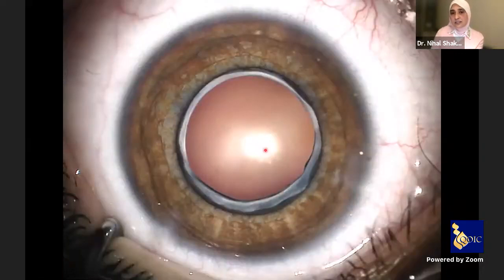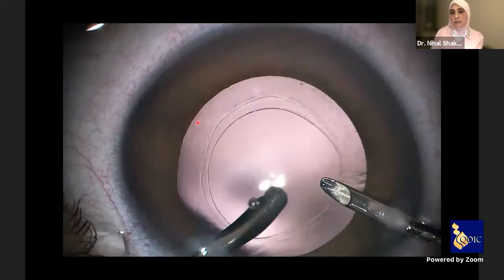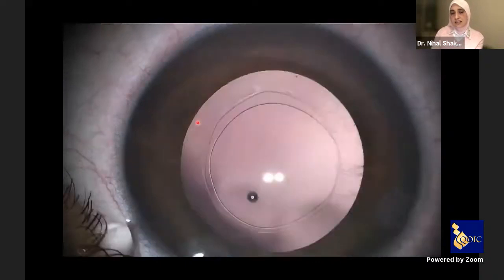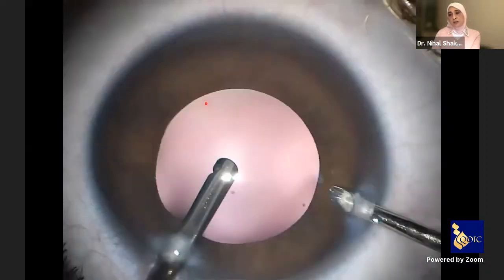Unlike congenital cataract, here just a few months or years after surgery you should have a viable capsule of support. This is another eye — a microspherophakia case — where we left a beautiful anterior and posterior rhexis at conclusion of surgery. A few months after surgery, extensive fibrosis and zonular elongation obstructed the visual axis, and we had to perform a vitrectomy again to clear the visual axis.